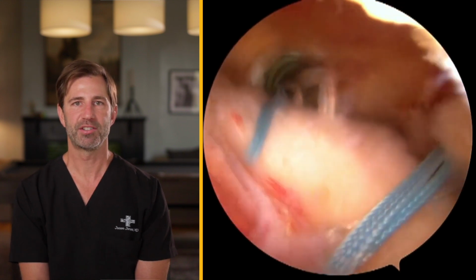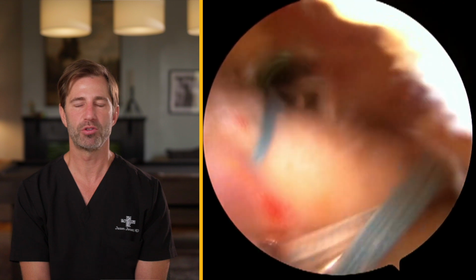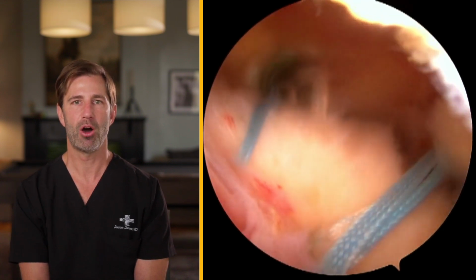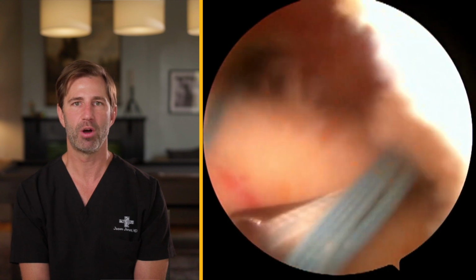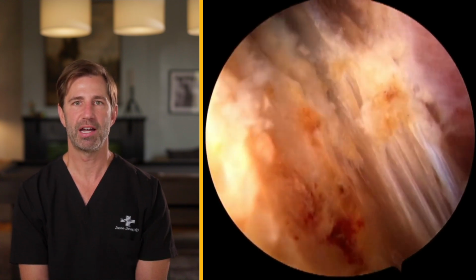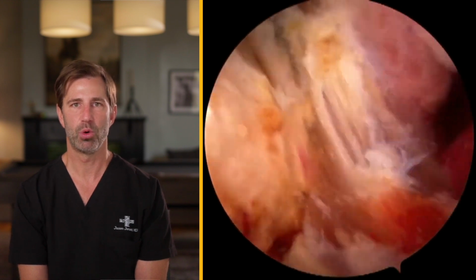After tying all these knots, what you see is that we've pulled the rotator cuff back into position. It's now covering the footprint, and it now is in the position and has the ability to go on to heal. Lastly, we're pulling 1 limb of each tied suture over and placing these into 2 what we call lateral row anchors.